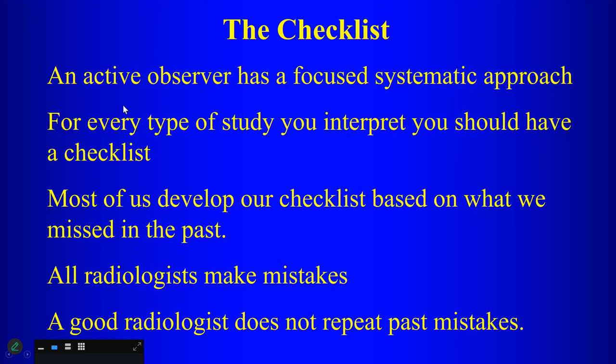Okay? The checklist. It's important to develop a checklist for everything, every kind of study that you're looking at. An active observer has a focused, systematic approach. For every type of study you interpret, you should have a checklist. Most of us develop our checklist based on what we missed in the past, which is a good thing, right? Because all radiologists make mistakes. The difference between a good radiologist and a bad radiologist is that a bad radiologist keeps repeating the same mistakes, right?